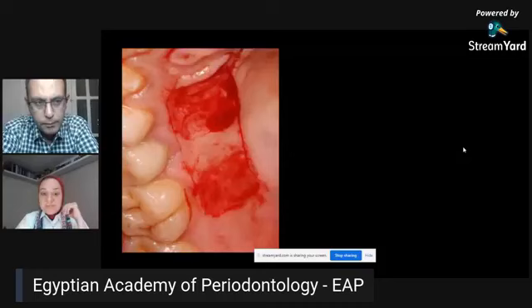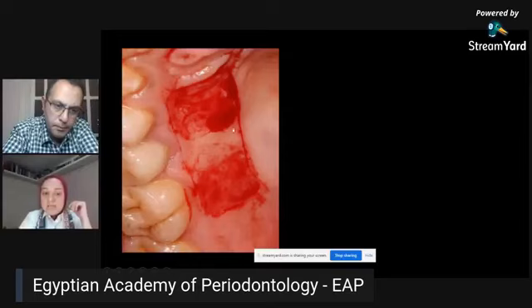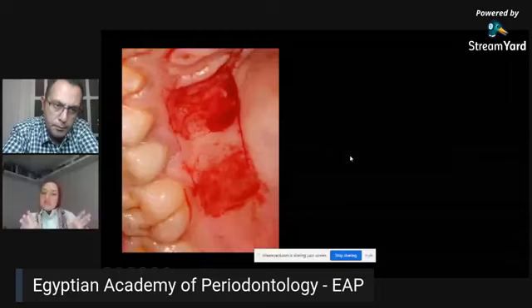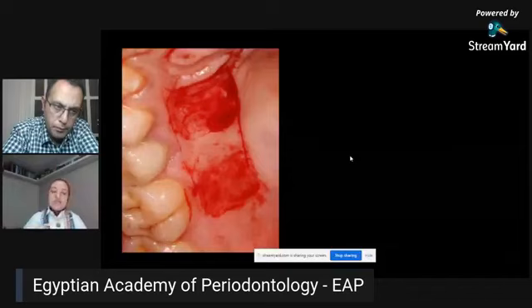Okay, so what we do is we get a connective tissue graft that has two wings of de-epithelialized tissues and a middle part of keratinized tissue or epithelialized tissues. What he did in his case report is that he harvested a free gingival graft on the bracket table, and then he de-epithelialized this wing and this wing, and then inserted the graft buccolingually, as I'm going to show you.